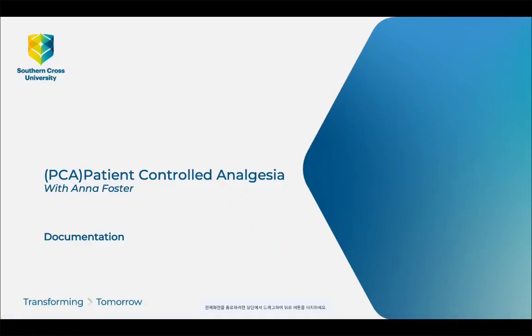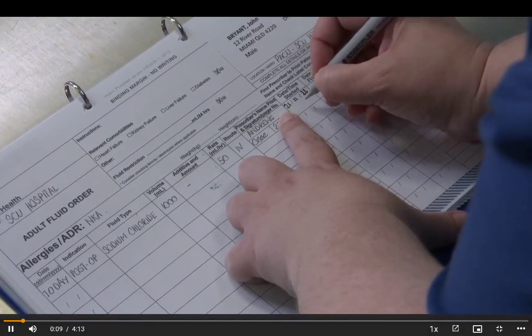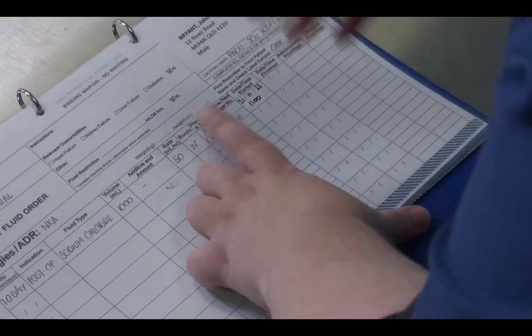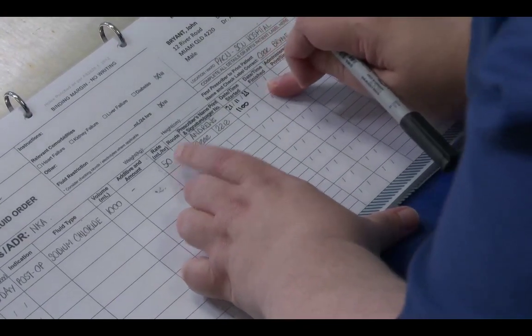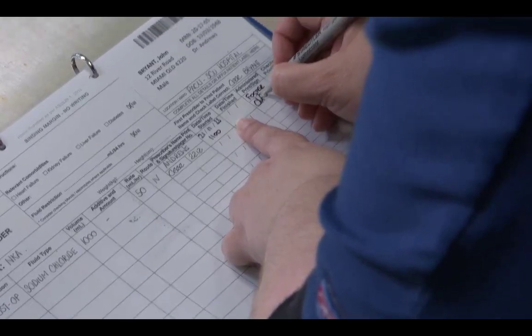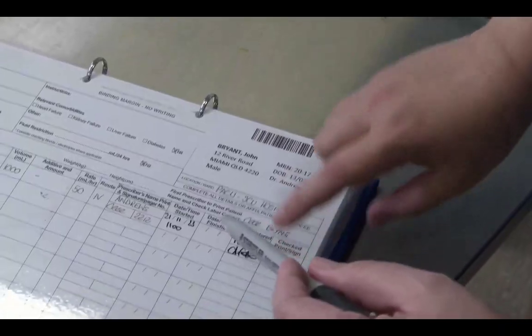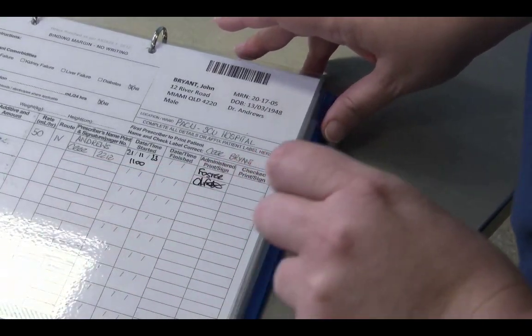I'm just going to sign this now, so I'm going to put the date in here, the 21st of the 11th, 23. As we said, it's 1100 hours. We aren't going to be here when it finishes because it's going to be running for ages at 50 mils an hour. So whoever is here when it finishes fills that out. I'm going to print my name here, Foster, and sign. And then I'm just going to get you to also print and sign your name just here, please. Thank you.